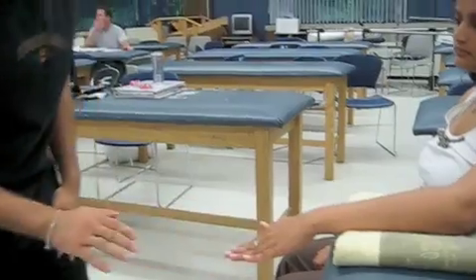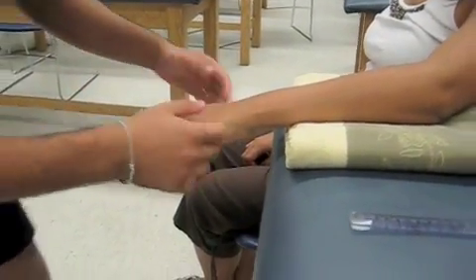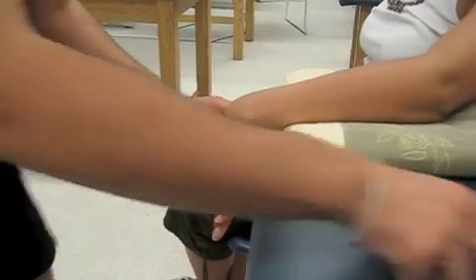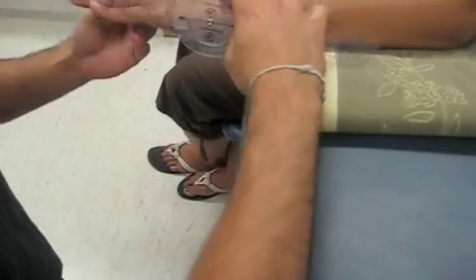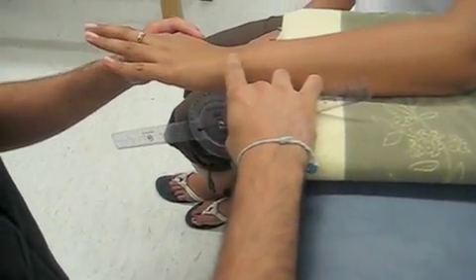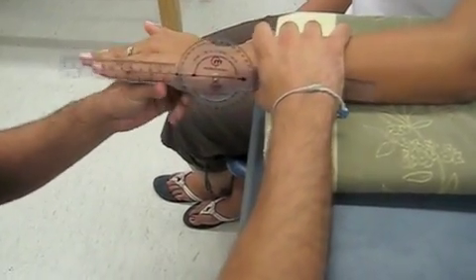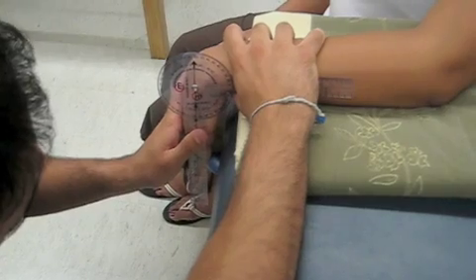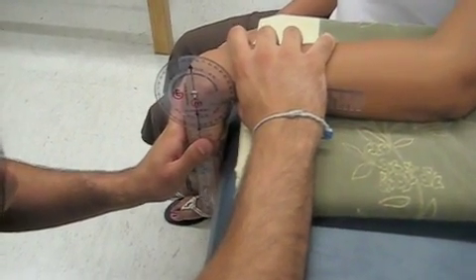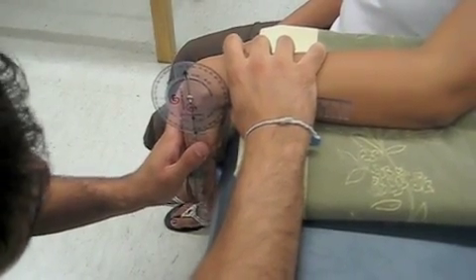Now we're going to do wrist flexion. I ask Deepo to flex her wrist, then I move her wrist into flexion and apply overpressure. The axis of rotation and the endpoints are the same — distal to the styloid process of the ulna. I move her wrist down with some overpressure, and we have 92 degrees of wrist flexion. The normal for wrist flexion is 80 degrees.